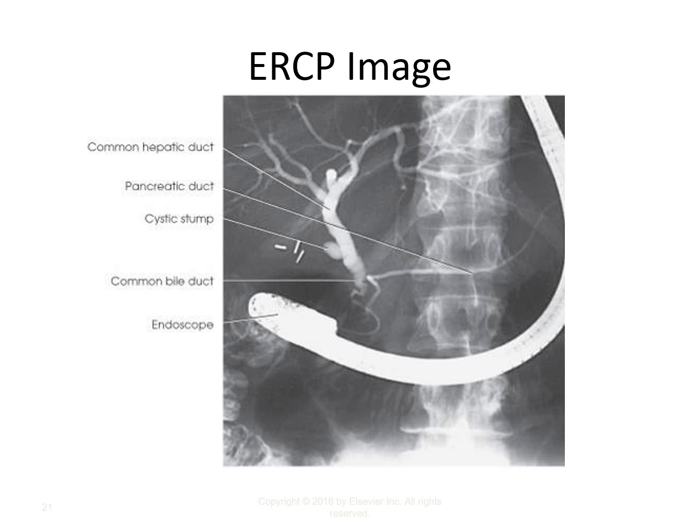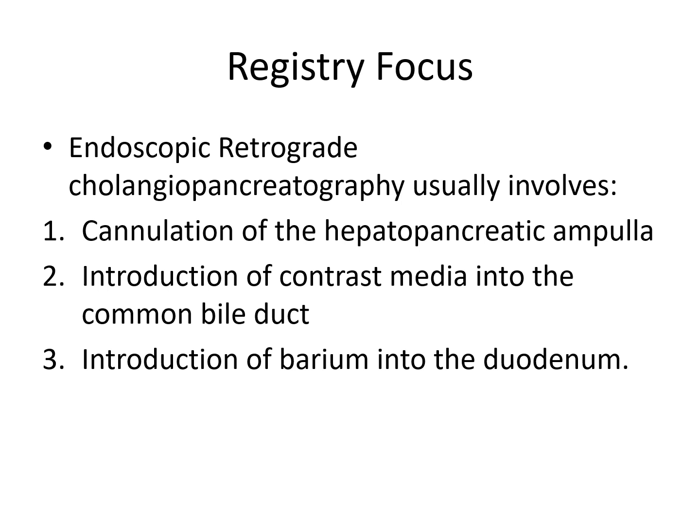In the case of cancer, sometimes you can get a pancreatic cancer that envelopes and closes and stenoses the common bile duct to the extent that it's extremely closed off, and you actually need to balloon stretch it open and then hold it open with a stent in order to get bile to pass.